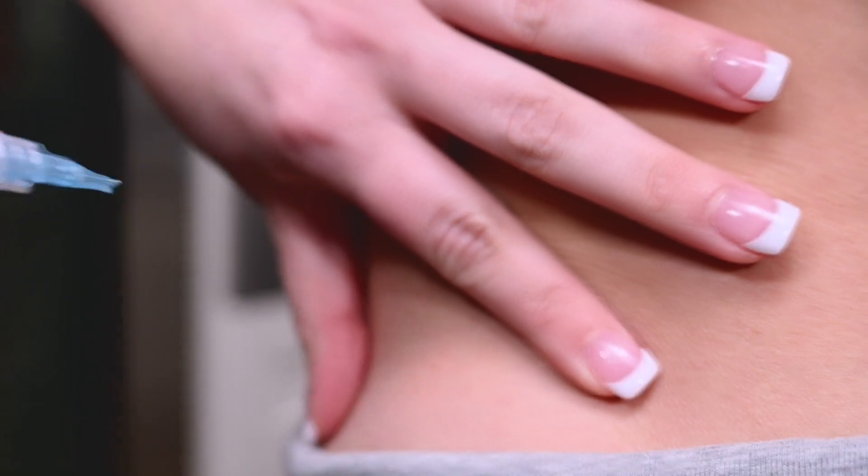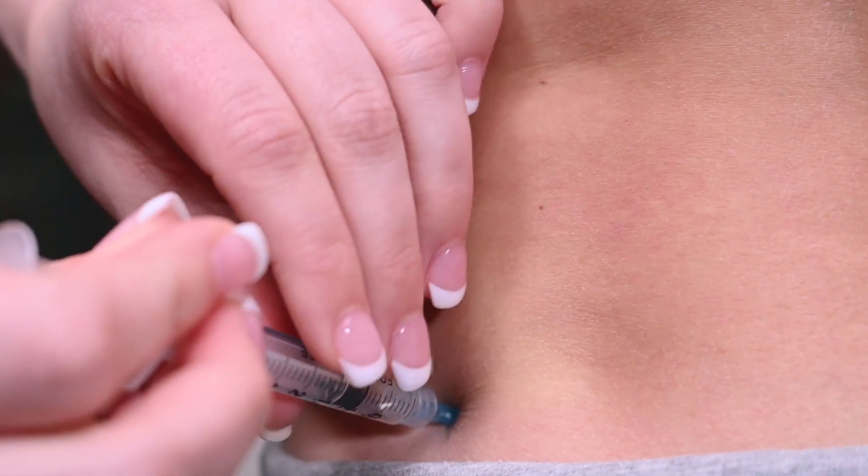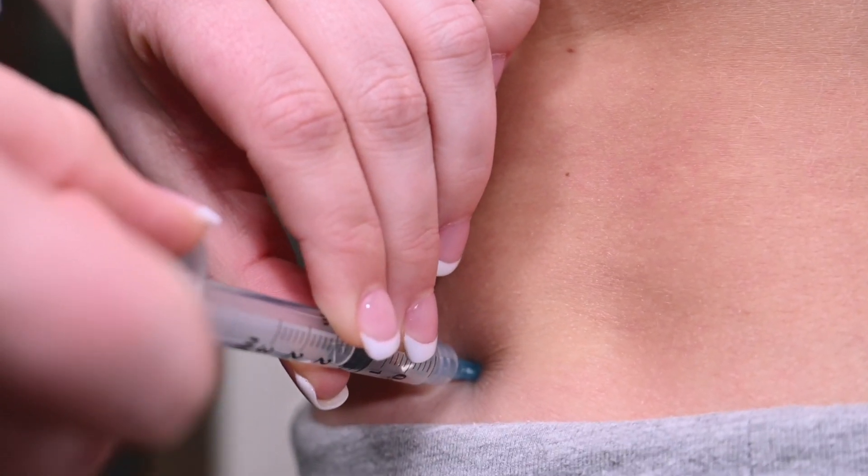Take the syringe in your preferred hand, stretch the skin between your fingers at the injection site, and insert the needle straight into the skin. Pull back slightly on the plunger. If no blood enters the syringe, proceed with the injection.